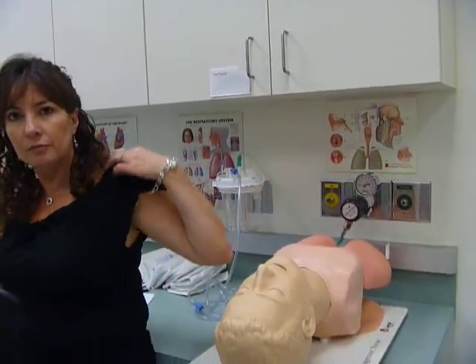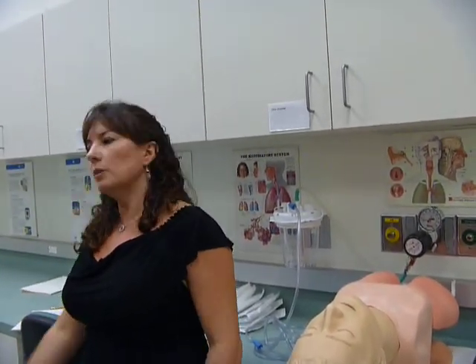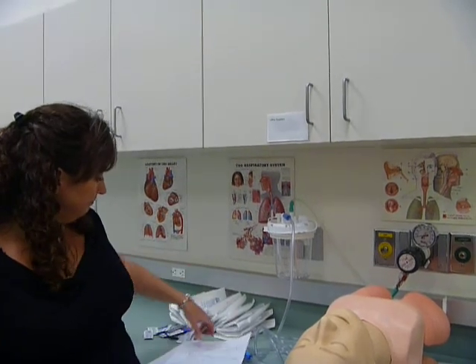The purpose of this is just to get rid of mucus, right? Right. And this would be done in a patient that is unable to clear it on their own. Sometimes they're too weak to cough it up. Sometimes they're not really responsive enough to cough it up. So if they can't cough it up, we will suction them. Why do we need to get it out of their lungs? So they can breathe. Right.